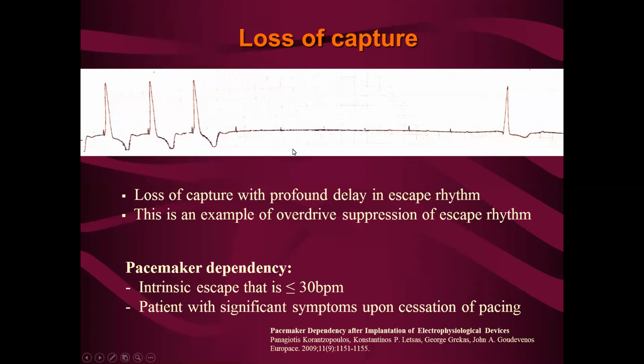In such a case, we would consider such a patient as pacemaker dependent. Pacemaker dependent is defined as a patient having significant symptoms upon cessation of pacing, or if the intrinsic escape rhythm is less than or equal to 30 beats per minute.